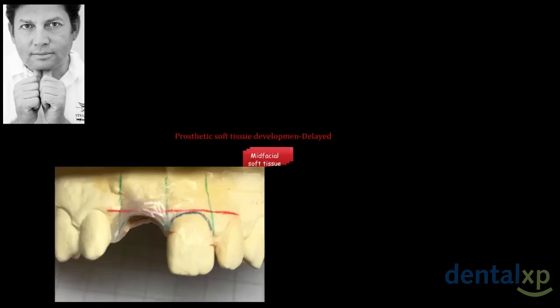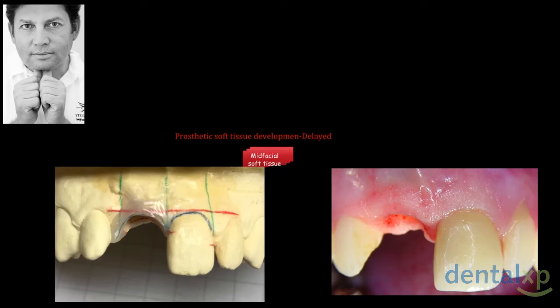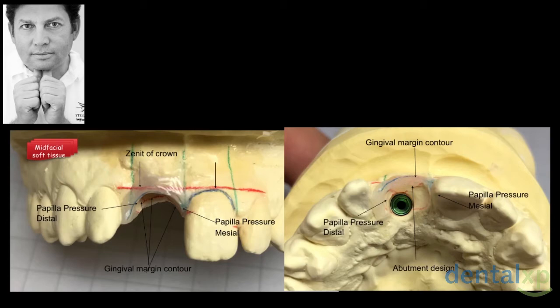To give you an example, this is a case published in 2004, and that's what you see, the older pictures. We created the frame where we have to stay within. We knew where to position the contact point and how much pressure should be on that contact point. This is an additive method. We put composite here to see what the frame is. My abutment can be concave, straight, convex, or undercontoured, as long as it doesn't cross these borders which we are creating in the lab. So you can see this is what we used to do in the past. Today we do all that digitally, and I will share with you.